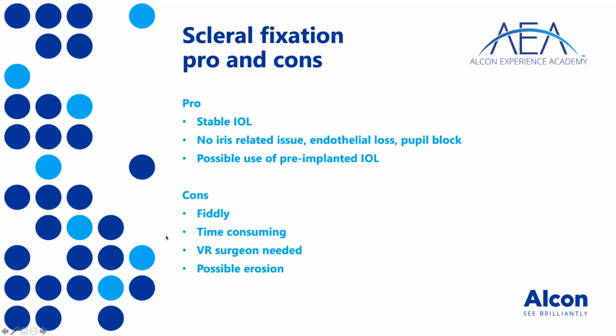And it's possible that you can use a pre-implanted IOL. So if you had a 3 piece IOL, which was implanted donkey's years ago and simply fell in the back of the eye, I've seen more than one colleague of ours being able to retrieve it, clean it from any remnant of the old capsule, etc., and use it to be reimplanted. In my opinion, it's a little bit hardcore, but it can indeed be done.